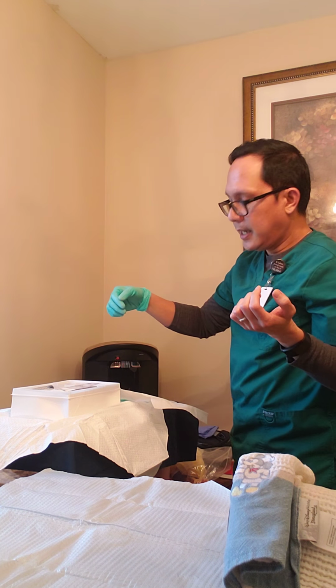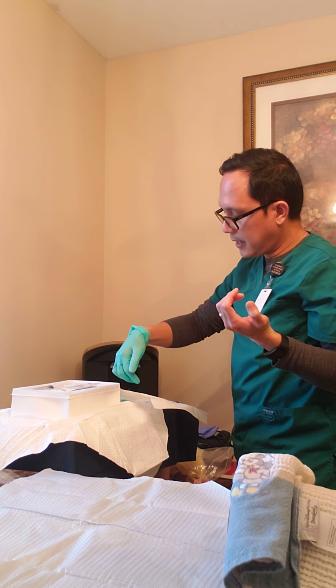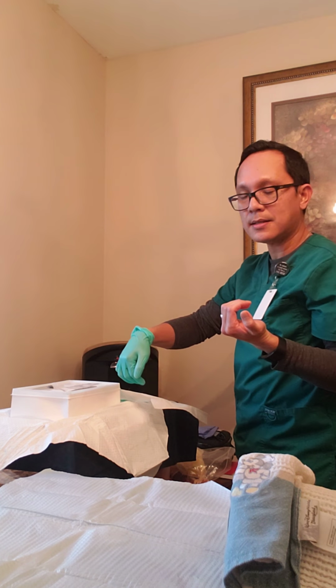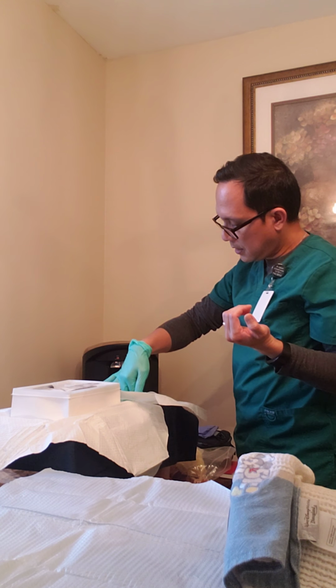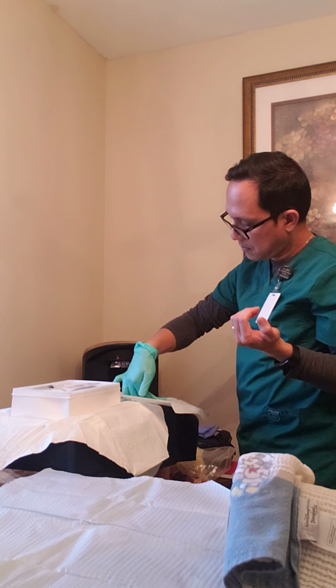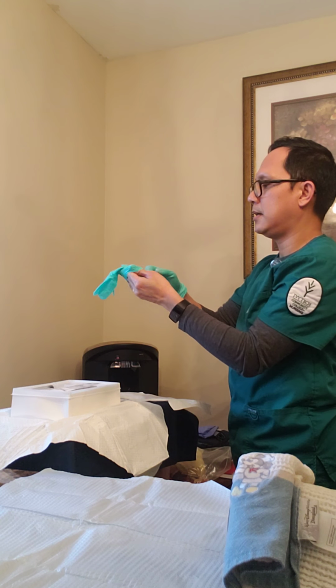And then I'm going to put the other glove on my non-dominant hand without touching the outside of the glove. I'm just going to slide it onto my non-dominant hand.